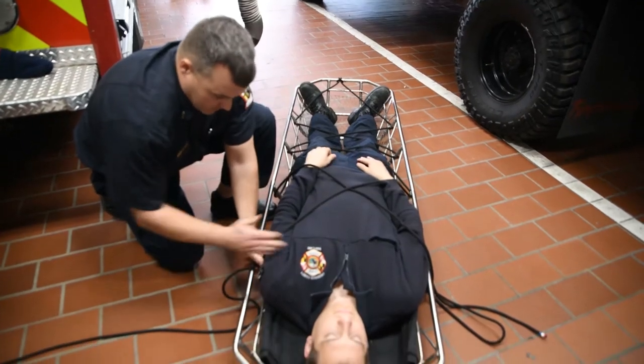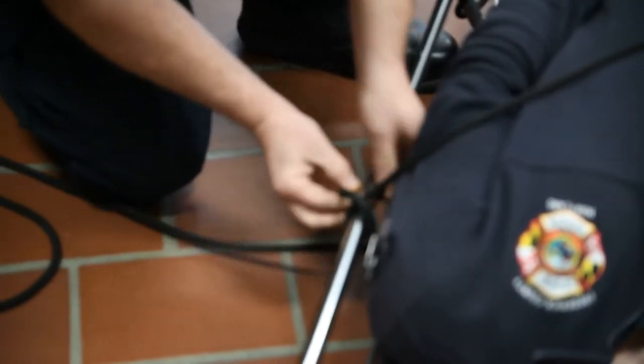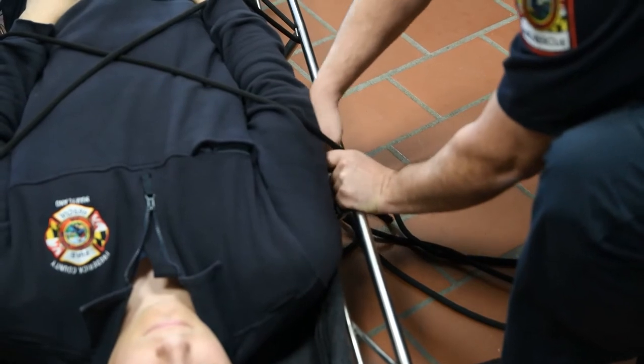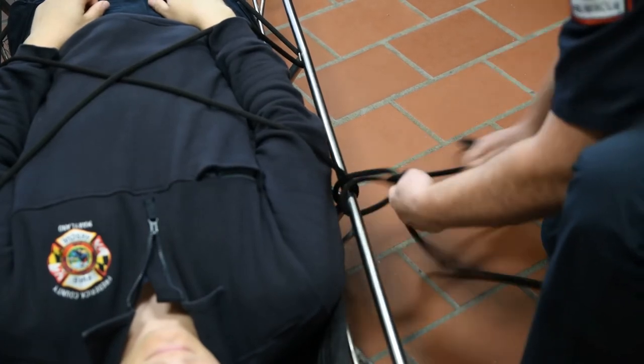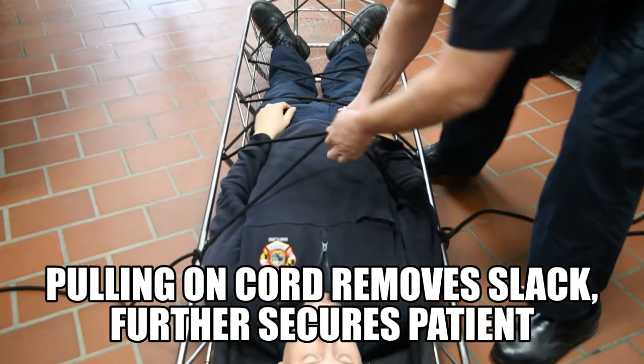Once we get up about even with the chest, this is where you do your split clove. Come back and re-tighten.